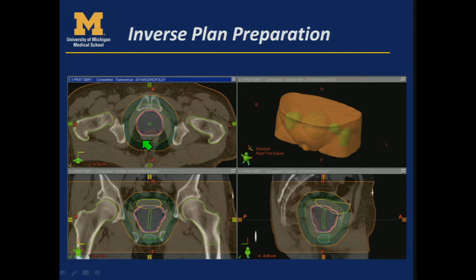created a treatment planning PTV. So here he's excluded the rectum and actually made a 1 millimeter margin around the PTV to really ensure good coverage right at the edge. So that's something that your inverse planning system may struggle with.